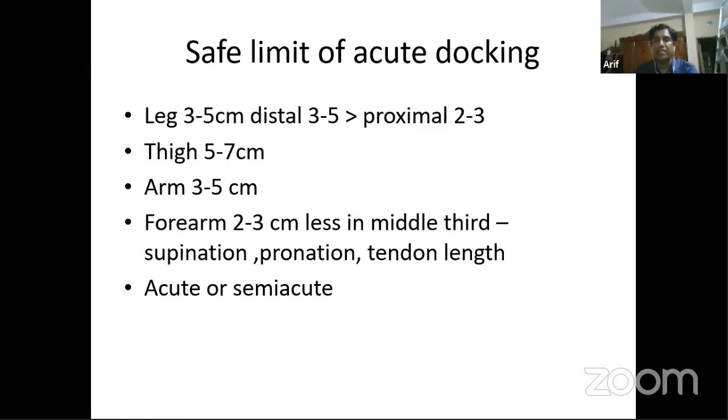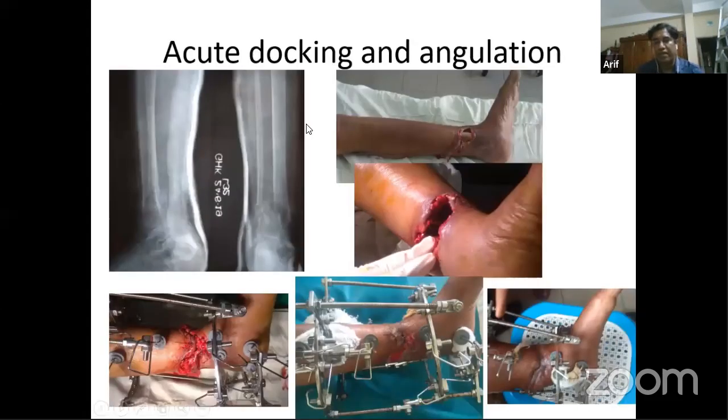Acute docking, these are things you should keep in mind. Usually in trauma conditions, this type of acute docking you practice very frequently. And now I'm going to show some clinical experience or clinical photographs of how acute docking can help in saving the limb and also improve your clinical outcome.